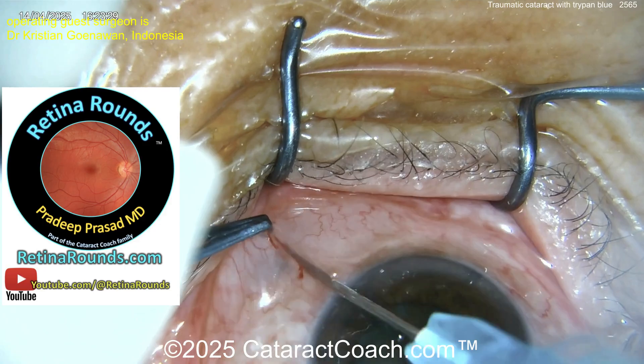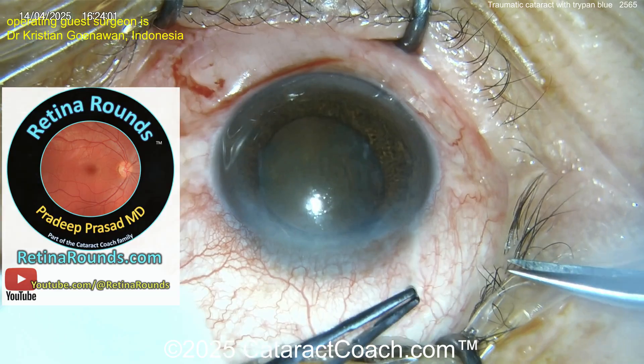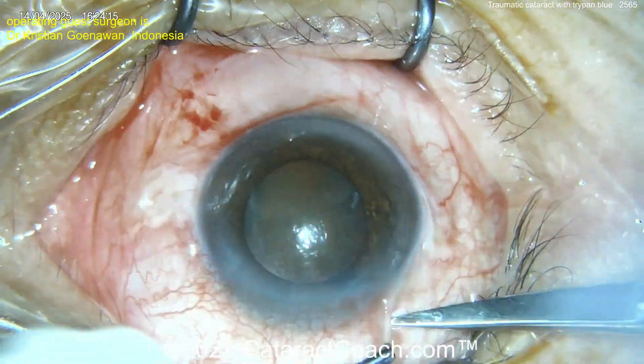Let me mention our sister channel Retina Rounds — so much great material for cataract surgeons. You could learn how to manage a case like this there, I promise. Now there's a sub-Tenon's block going in.